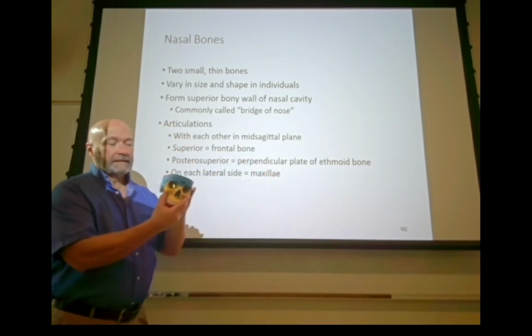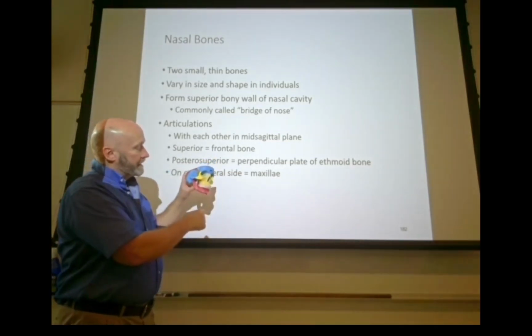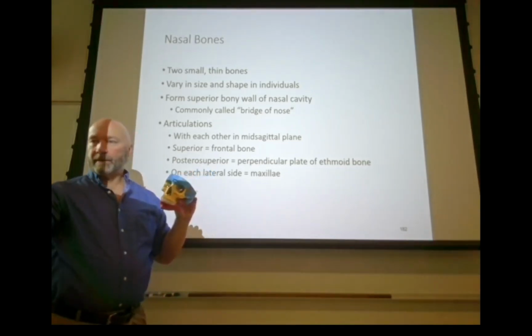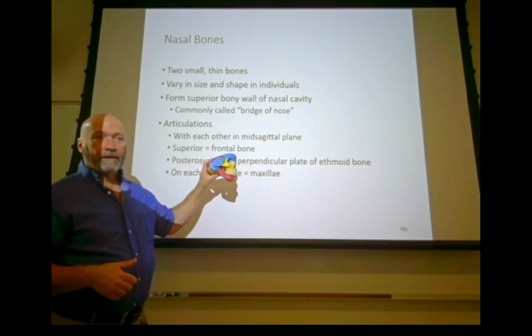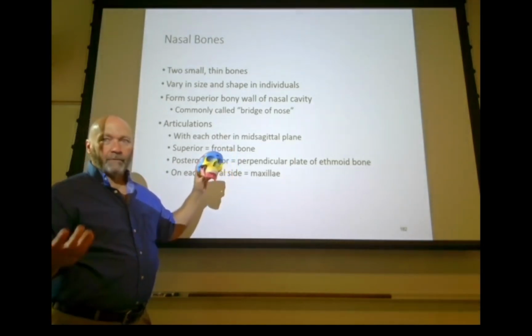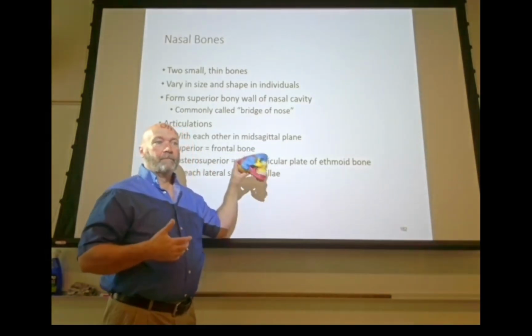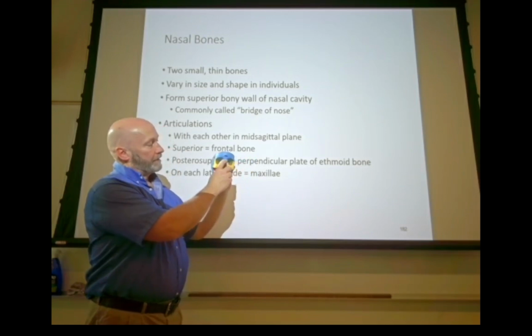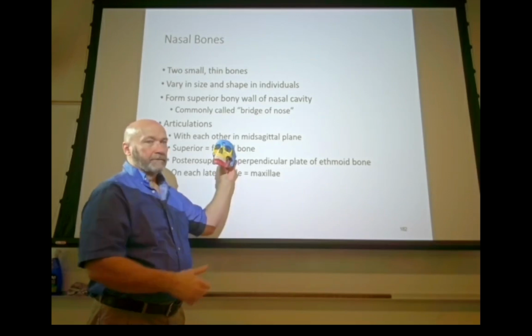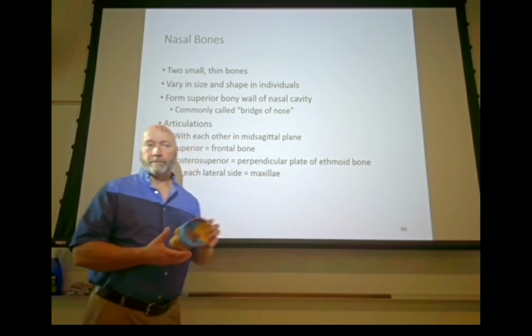Lateral in this case, positioning-wise, is going to be the same, but our central ray is just going to be to the nasal bone, about a half inch distal to the nasion, and our collimated field is about the size of your thumb. You just don't need a whole lot. So that will be your nasal bone series: 37 Waters for the nasal septum, and both laterals, because you've got two nasal bones, and both of them are at a funny angle to the central ray.